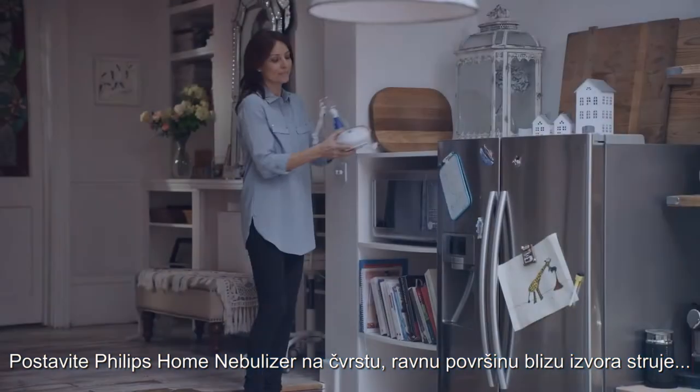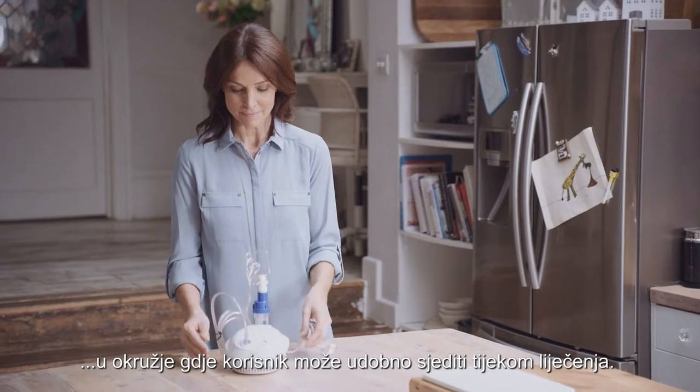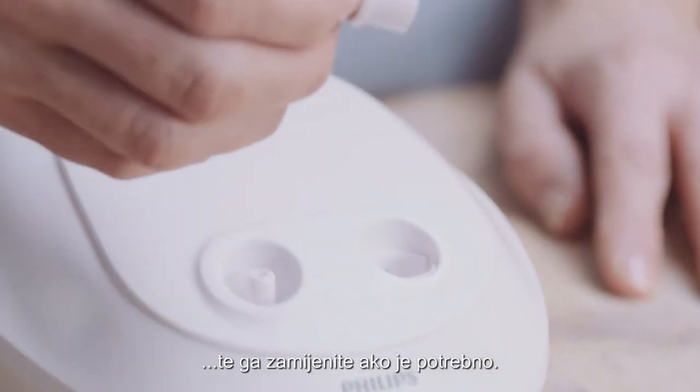Place the Philips Home Nebuliser on a firm flat surface near an electrical outlet in an area where the user can be seated comfortably during their treatment. Check that the filter is not clogged, dirty or wet and replace if necessary.